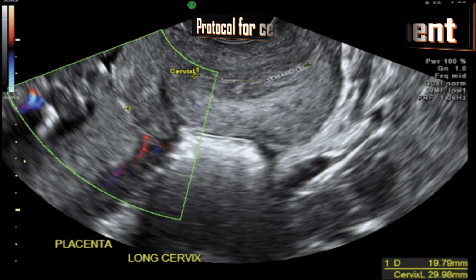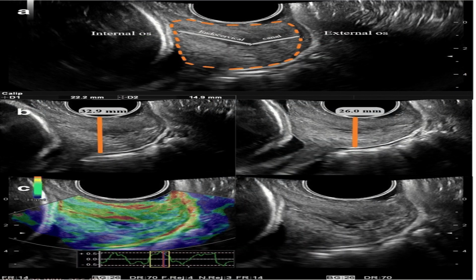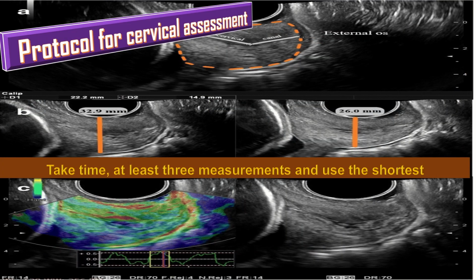Be aware of segmental contraction of the lower uterus. Avoid excessive pressure with the probe because it may cause inaccurate estimation of the cervical length. Take time, take at least 3 measurements, and use the shortest one.